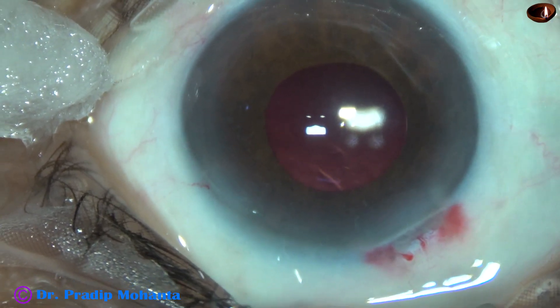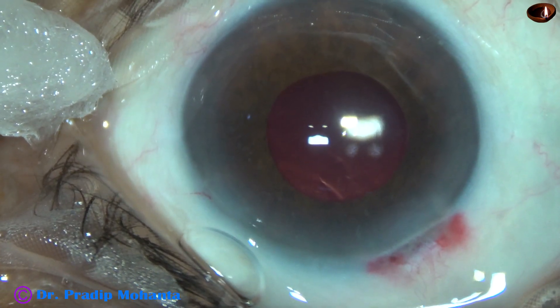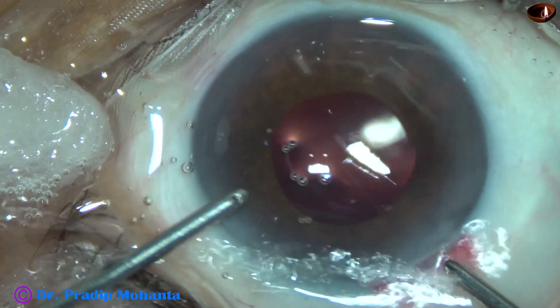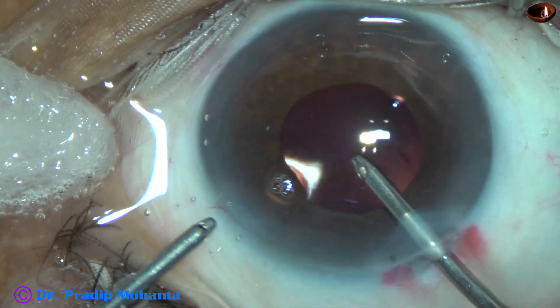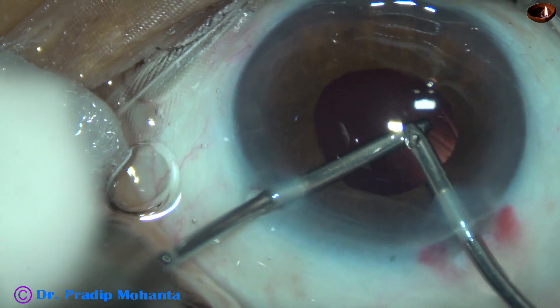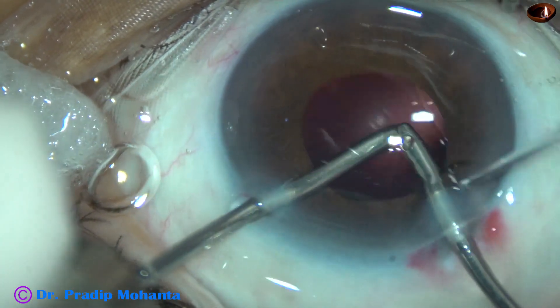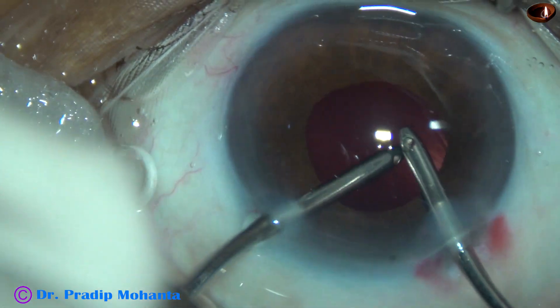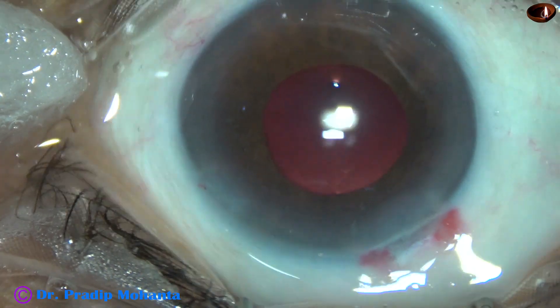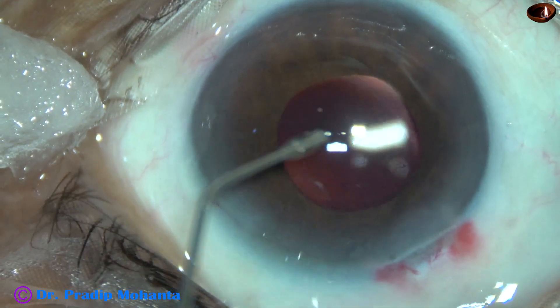The irrigating probe of bimanual I/A should not be used initially because the anterior chamber is filled with viscoelastic and it will cause a lot of high pressure, as most of the visco will not be able to come out with such high flow of irrigating fluid. Now I am using irrigation and aspiration. The irrigating probe has gone through the main wound and it is lifting the main wound, and thus egress of the fluid becomes less if we lift the anterior lip of the main wound.